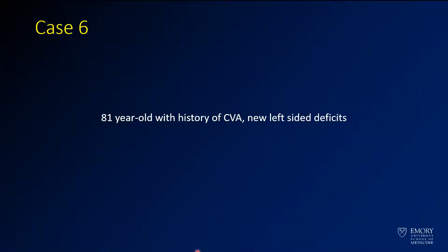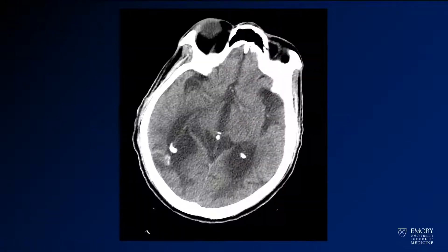For K6, we have an 81-year-old man with a history of stroke or CVA and with new deficits. Here we see brain CT with multiple areas of hypodensity. We've got big ventricles, big Sylvian fissures, so we know there's some volume loss, but then we see some area of hyperintensity that's concerning for hemorrhage.